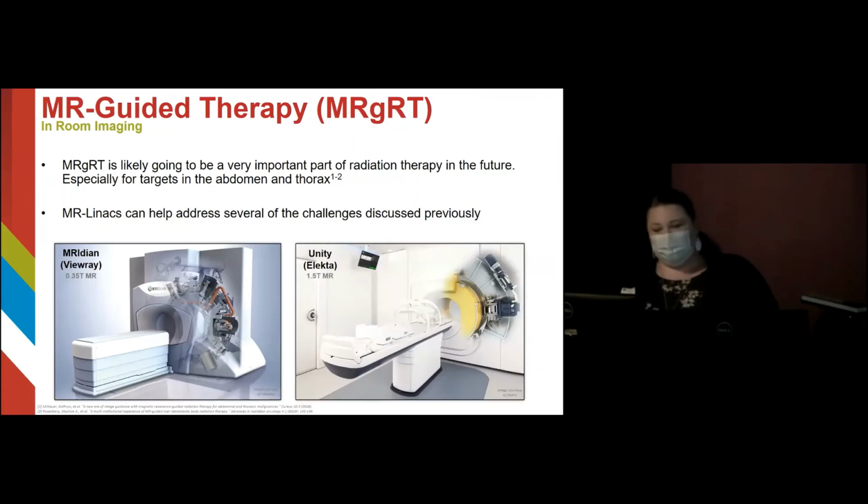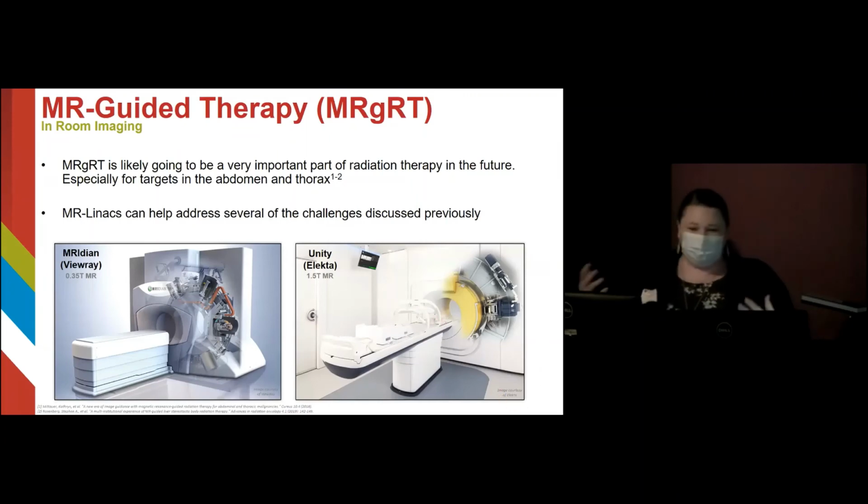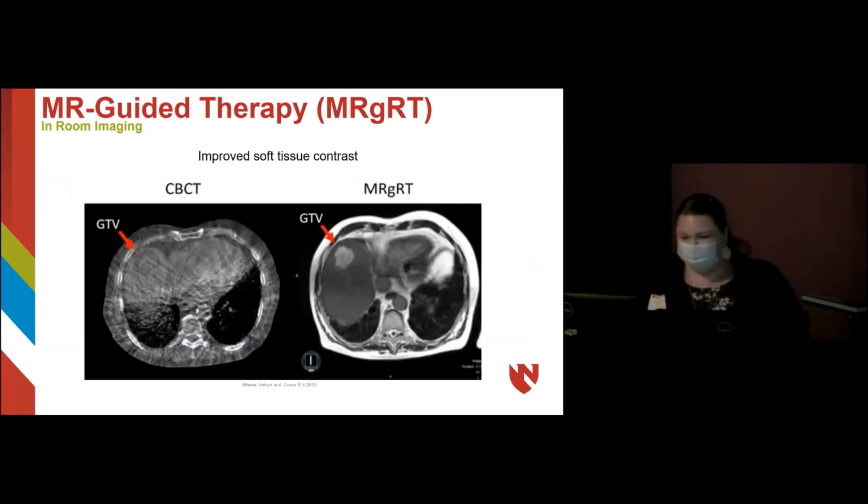All right, so lastly, I'm going to briefly mention MRI guided therapy, since I think it's likely going to be a very important future direction in our field. Currently, there are 2 MR Linacs that are commercially available, ViewRay's Meridian and Elekta Unity. And MRI guided therapy is promising because it can address several of these challenges that we've talked about earlier. So firstly, these machines allow us to set up the patient using a 3D MR image right in the room. Obviously, MR is going to give us superior soft tissue contrast compared to a cone beam CT, and this allows us to align the target more precisely.